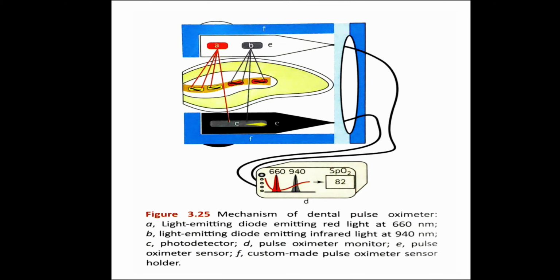This is a photo detector. This is the pulse oximeter monitor, and this is the pulse oximeter sensor, and this is the custom made pulse oximeter sensor holder.